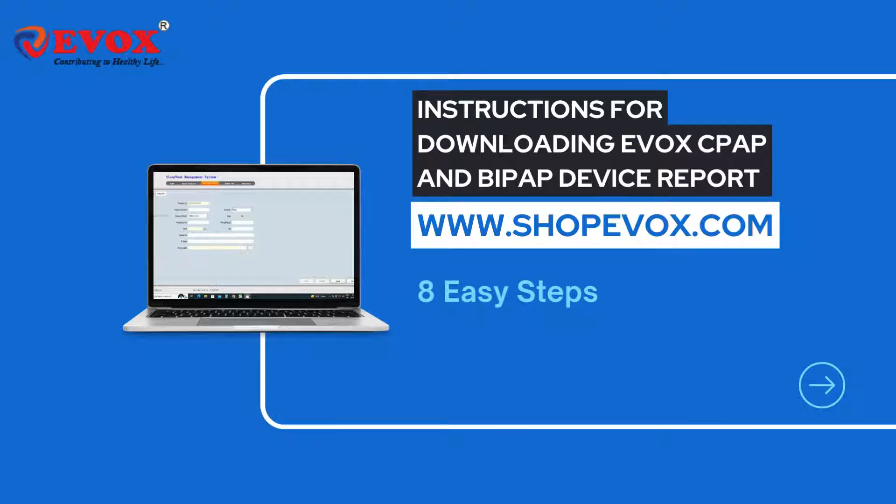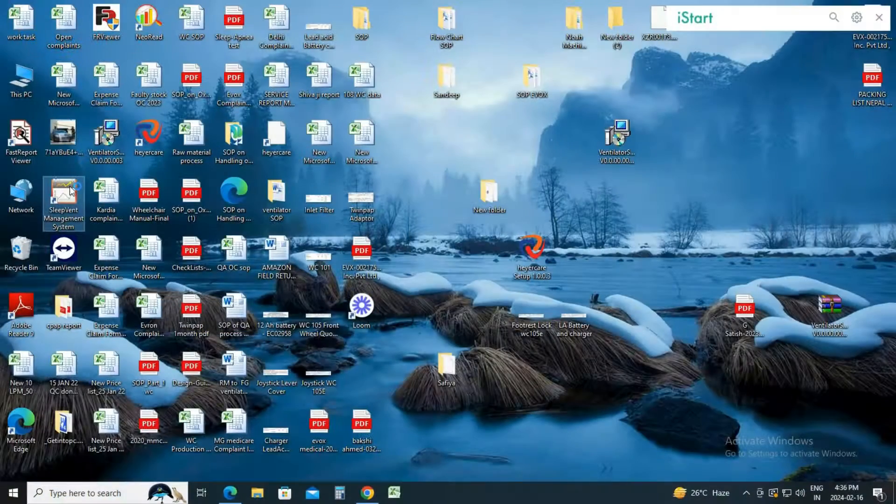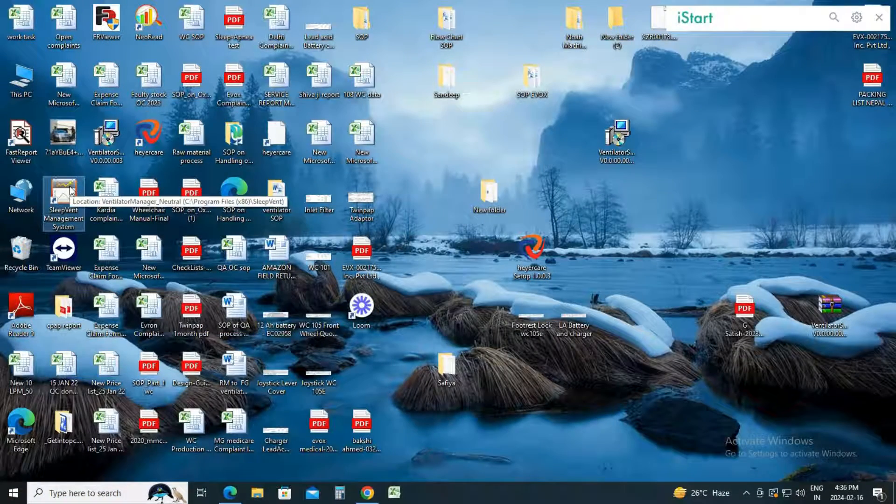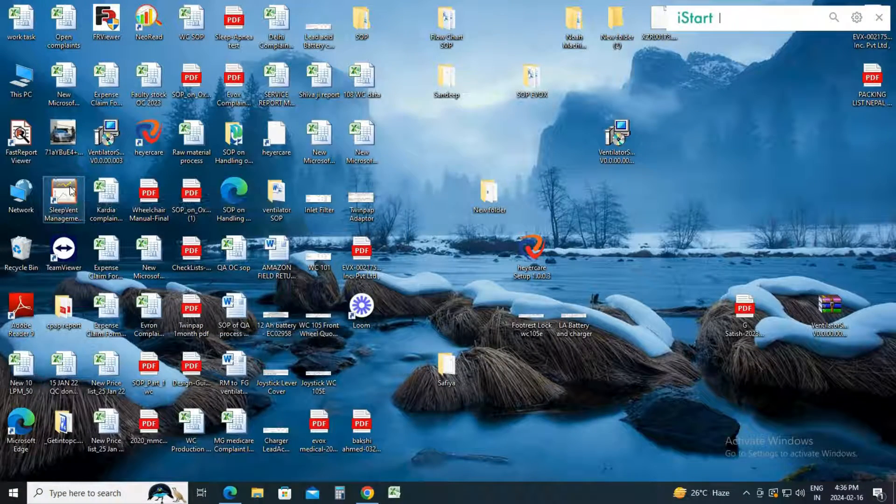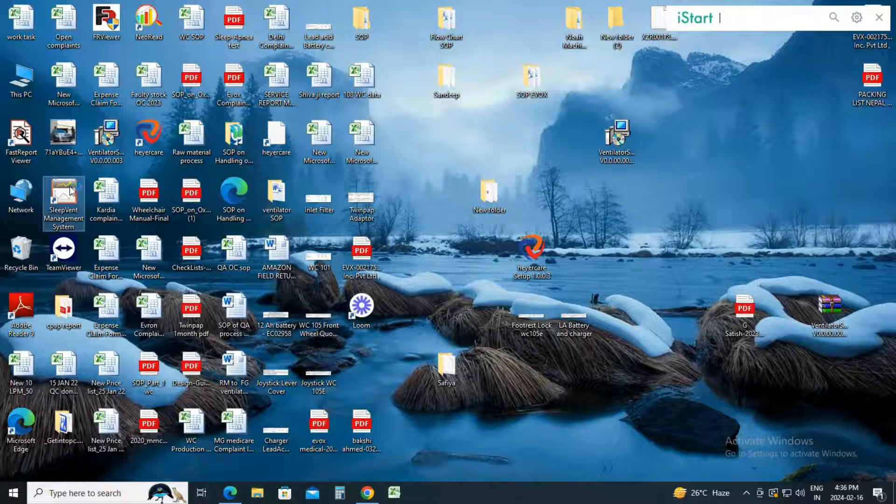Once the software is downloaded and installed on your system, you will see an icon named Sleep Vent Management. Click on the icon to open the software.